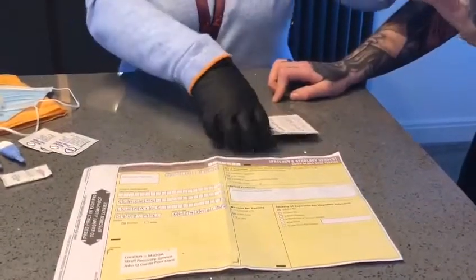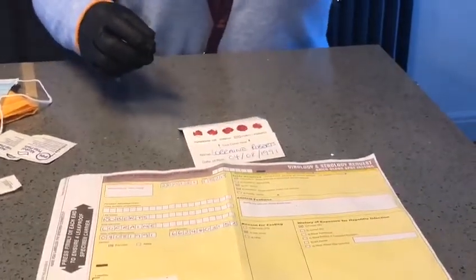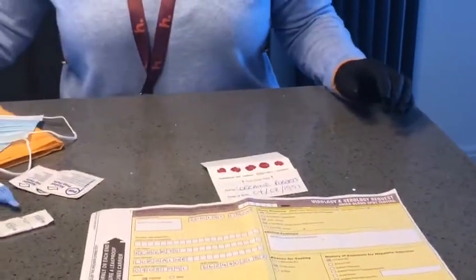When your card is completely full, you'll put it to one side to dry. You will then ask your client to go and wash their hands again in warm soapy water and apply a plaster.